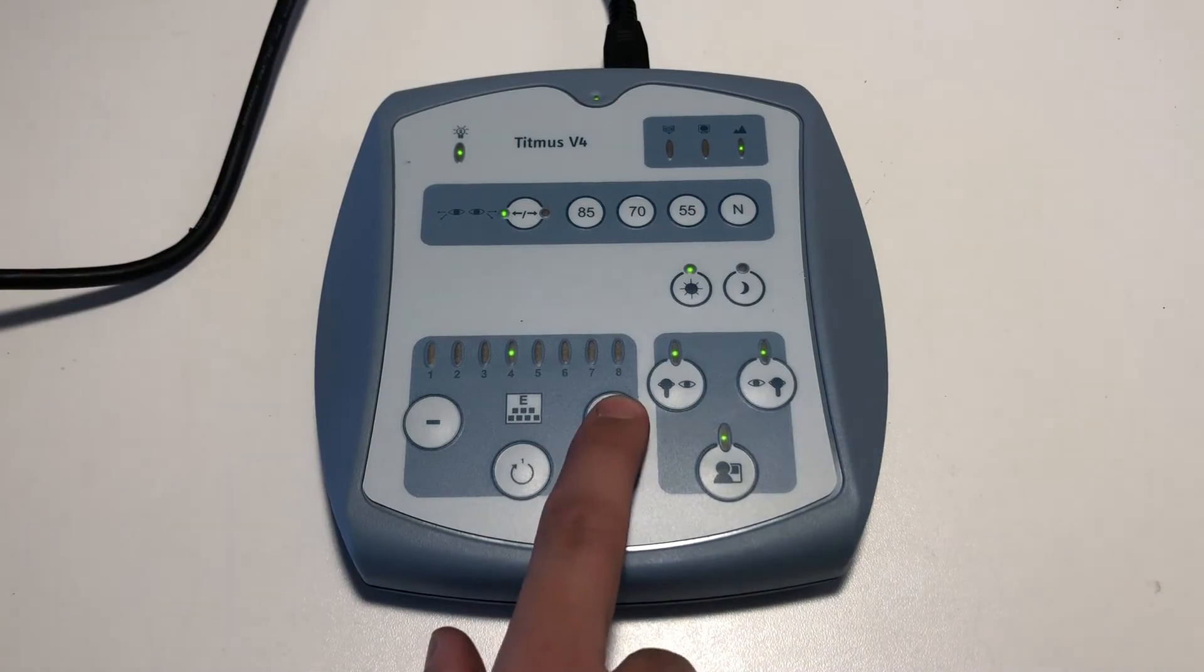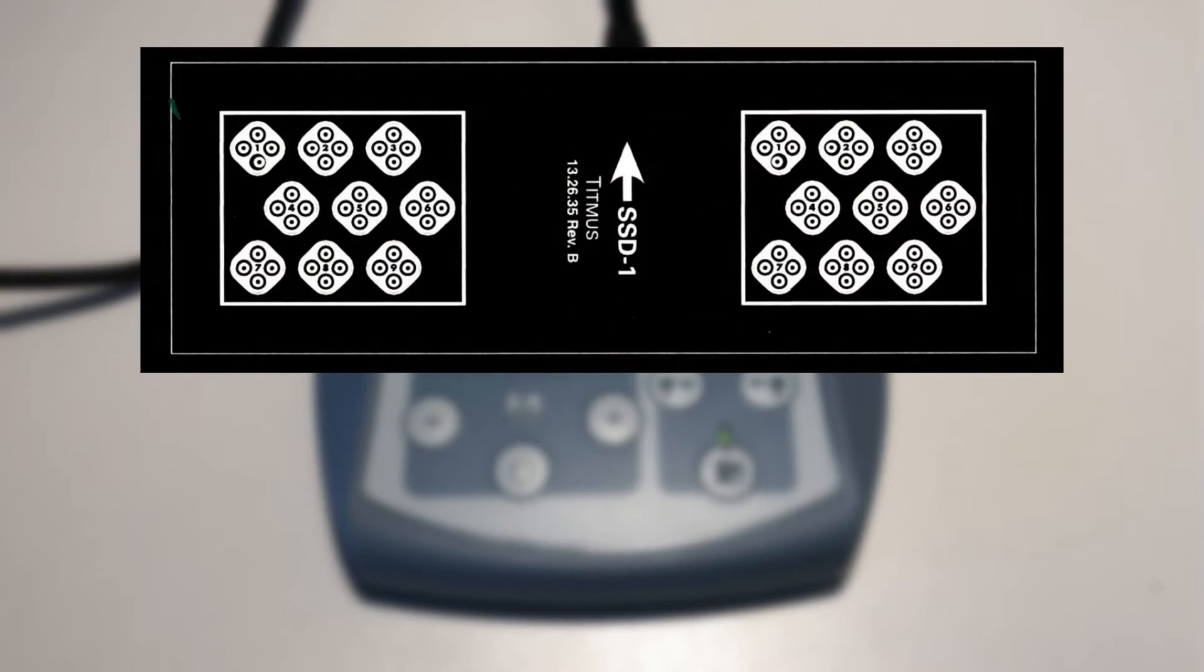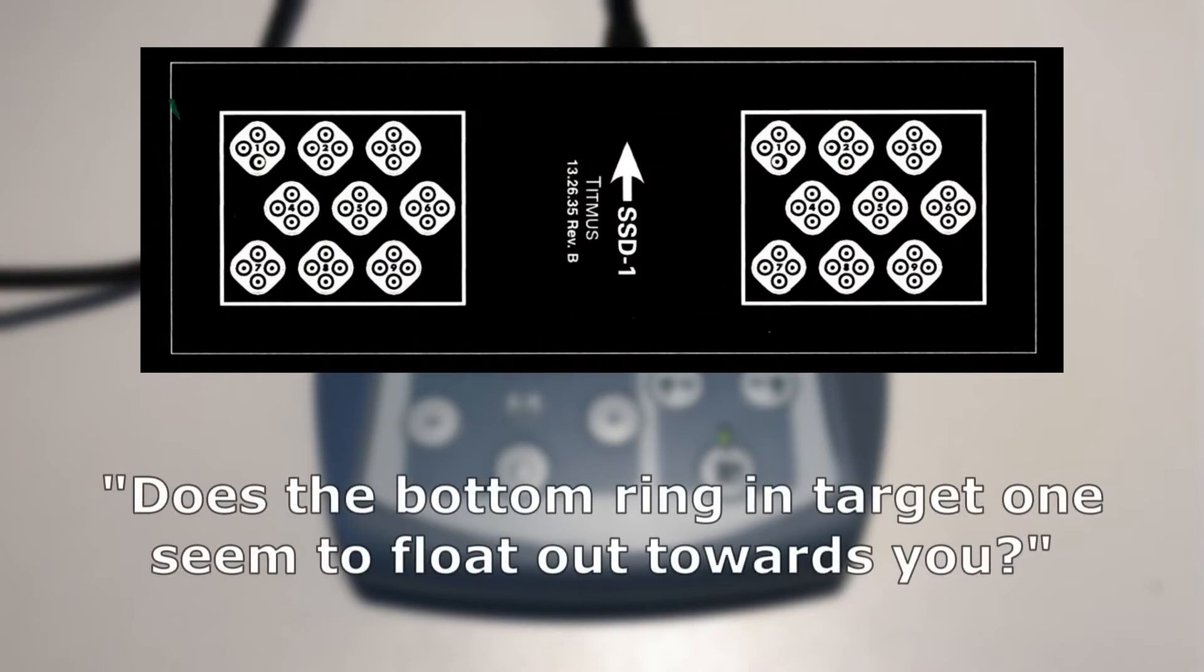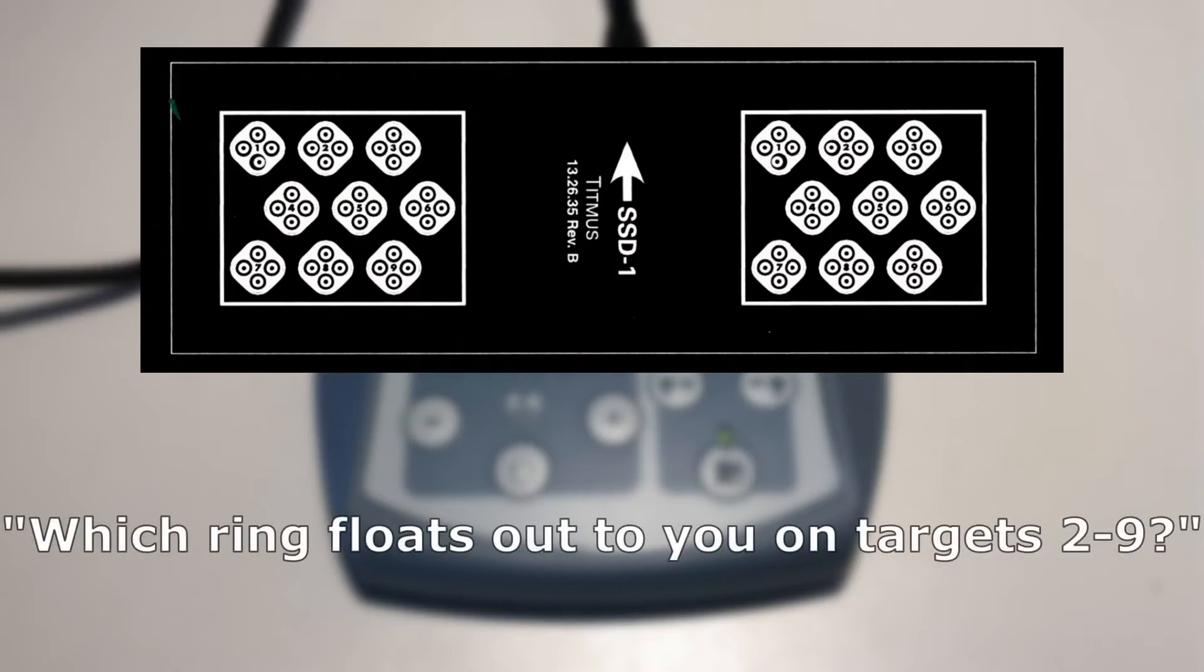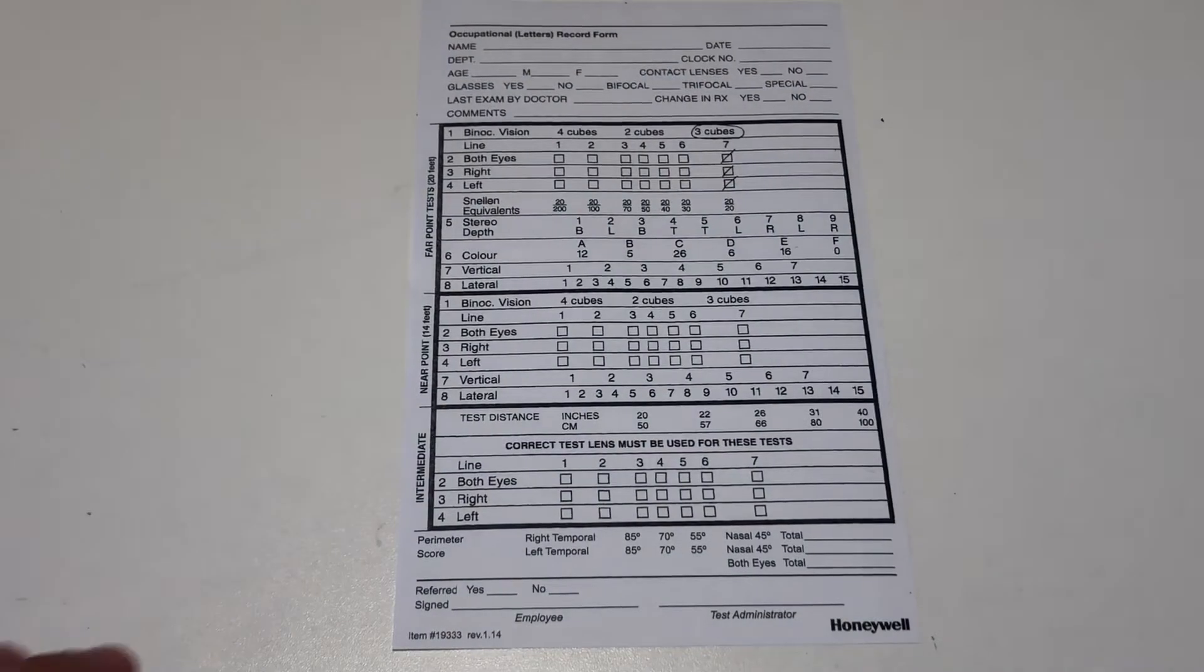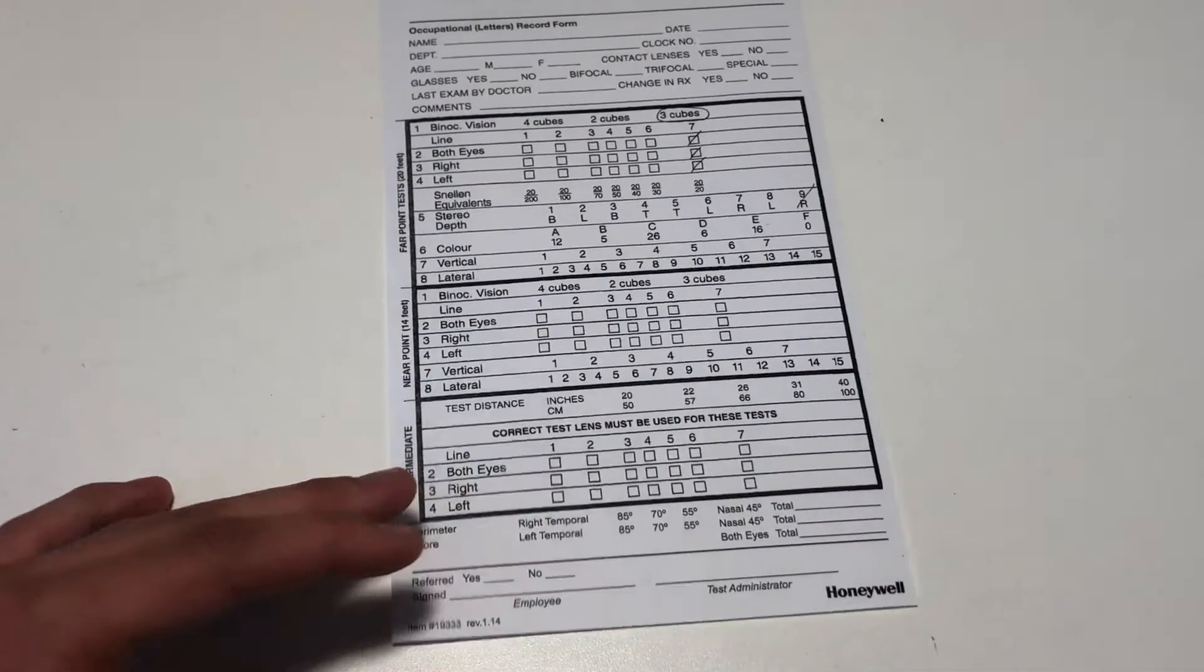Advance the slide to number five. This slide tests for depth perception. Ask the patient, does the bottom ring in target one seem to float out towards you? If no, move on to slide number six. If yes, say to the patient, tell me which ring floats out towards you on target two. Repeat for all nine targets and record the results by putting a slash through the last correct answer.